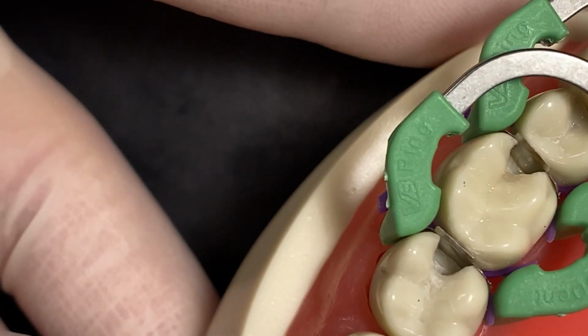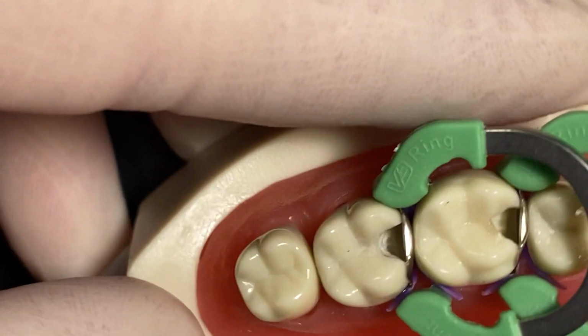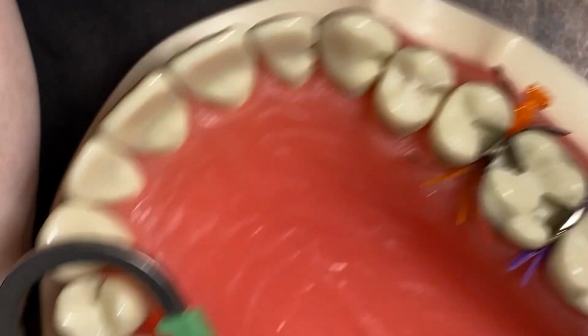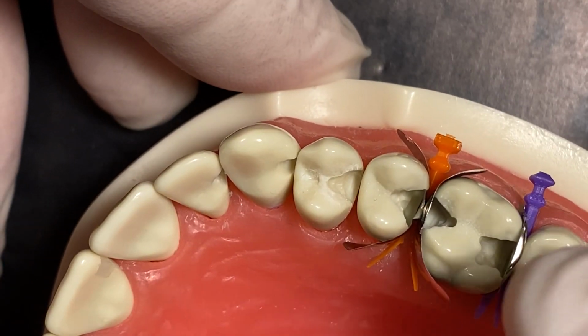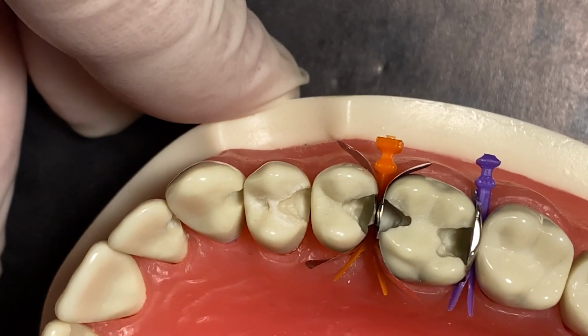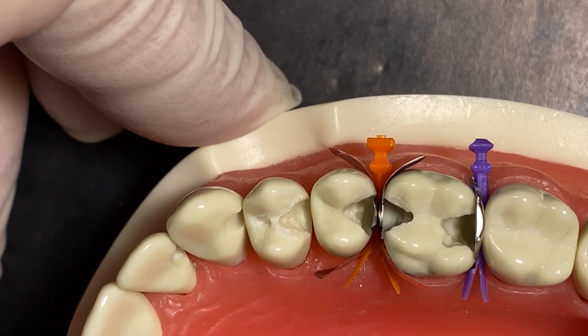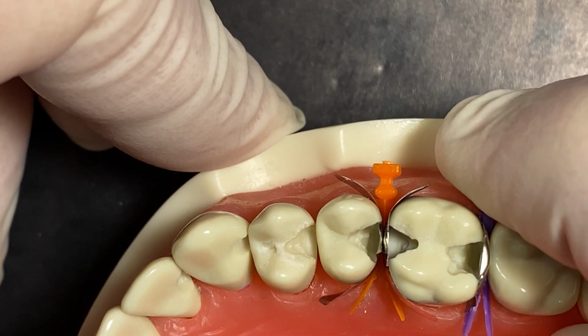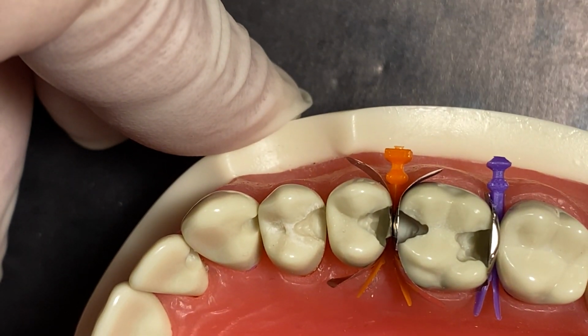So it's a very unique device that streamlines basic quadrant cases like so, but can also be really effective in these unique cases where I found myself having a hard time trying to decide how to manage this and how to become more efficient. Just having a single matrix wedge unit on one of these surfaces really makes a difference.